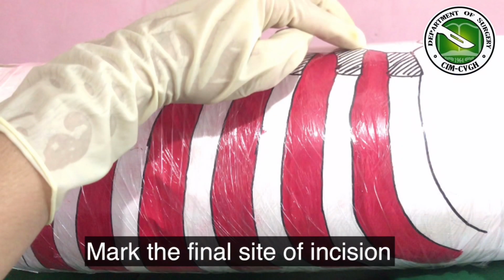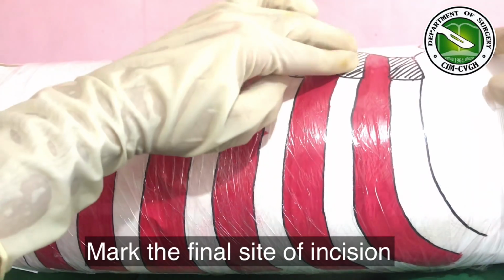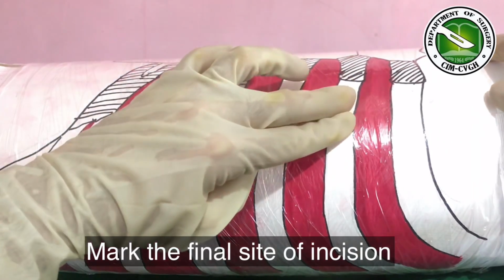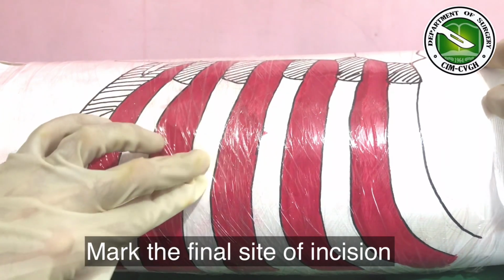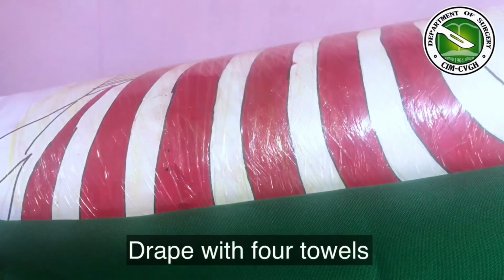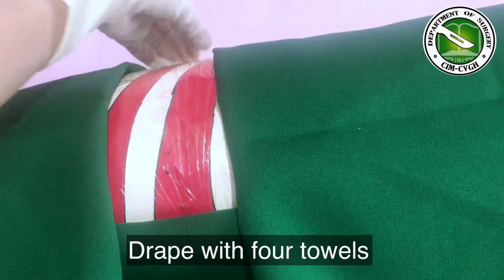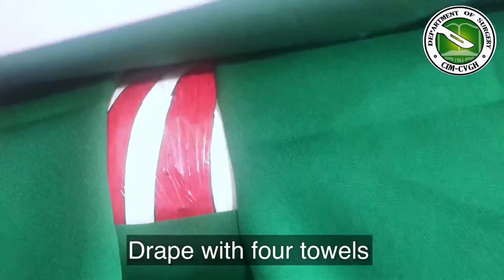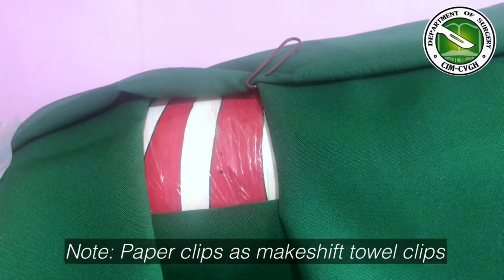Mark the final site of incision. Go to the angle of Louis and move your fingers to the second ICS. Then trace down to the next few ribs until you locate the fourth ICS at the anterior axillary line. Drape the area with 4 towels and not with a single fenestrated sheet. Secure the towels with towel clips.